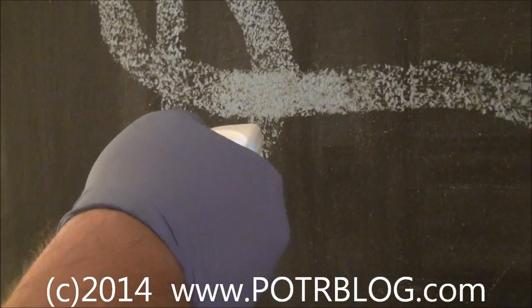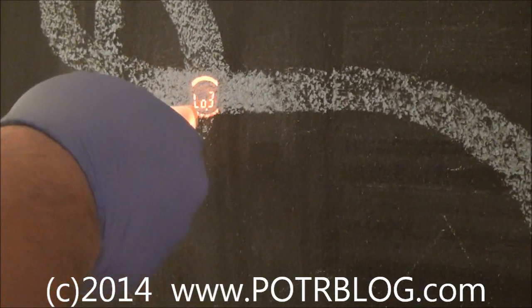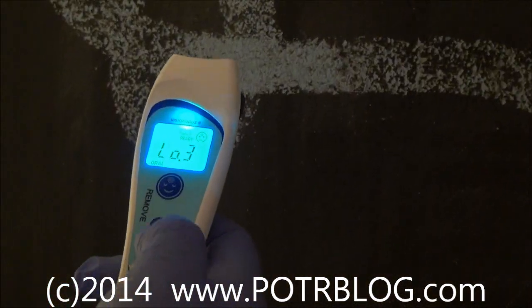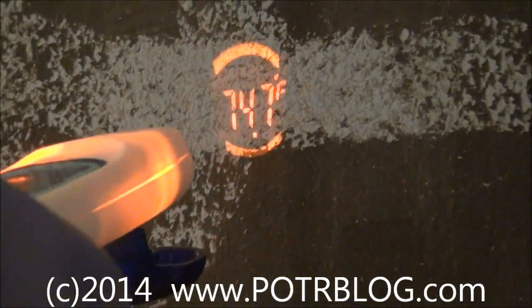You can see it's not letting me take a reading here because I pushed the face button, and it says that's too low of a temperature for a human. So I have to push the home button, which says I'm taking something in the house, and then it gives me the accurate temperature of the object.